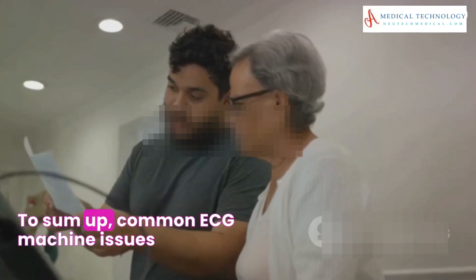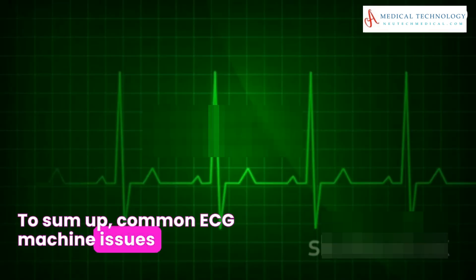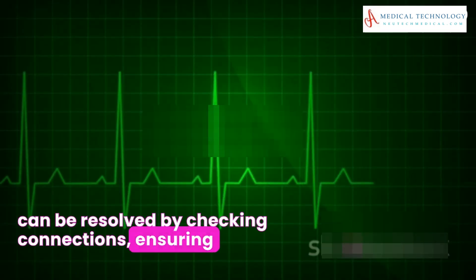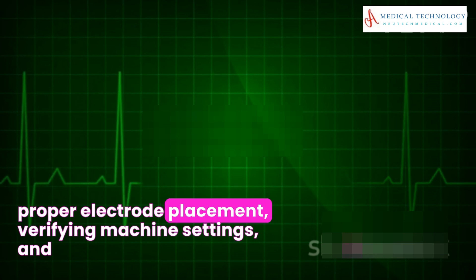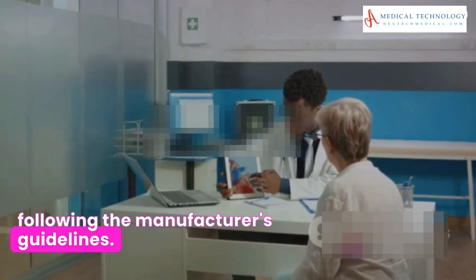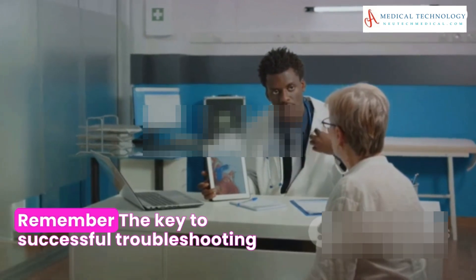To sum up, common ECG machine issues can be resolved by checking connections, ensuring proper electrode placement, verifying machine settings, and following the manufacturer's guidelines. Remember, the key to successful troubleshooting is patience and attention to detail.